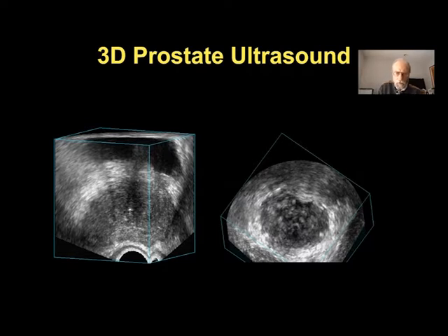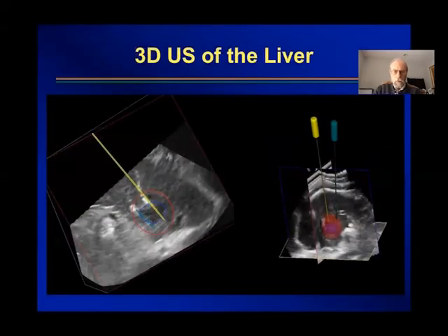All this technology has already been used in clinical trials and has been licensed to a company which is selling it worldwide. Another application is image-guided focal liver ablation. This uses applicators which are inserted into the liver, into a tumor, and then either radiofrequency or microwave energy is used to ablate, or thermally heat, the tumor to destroy it.